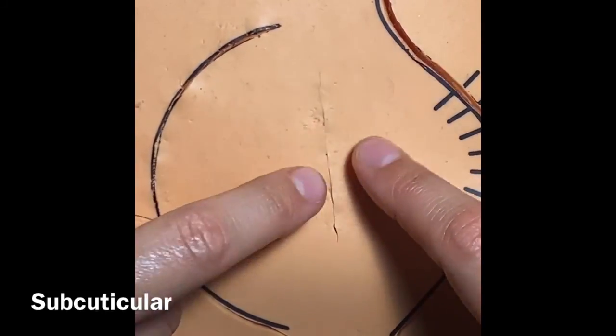Completely buried underneath the skin surface. That will absorb over time and the patient will never have to get their sutures out.